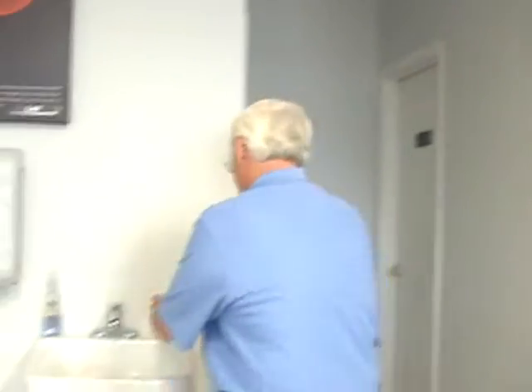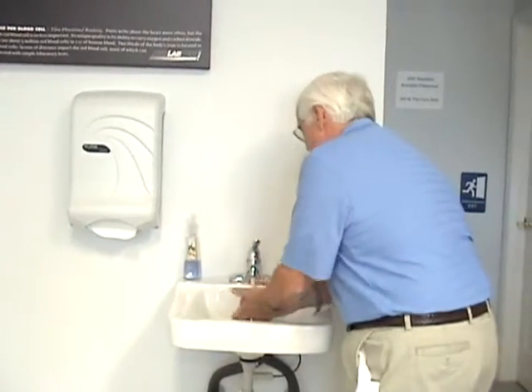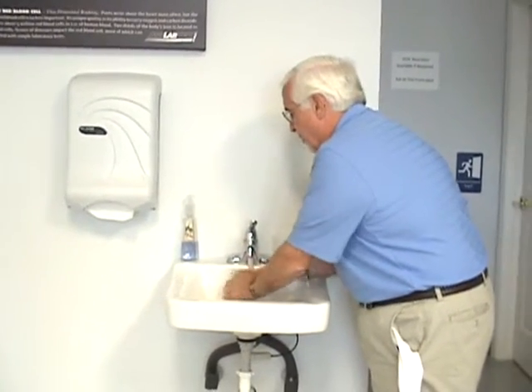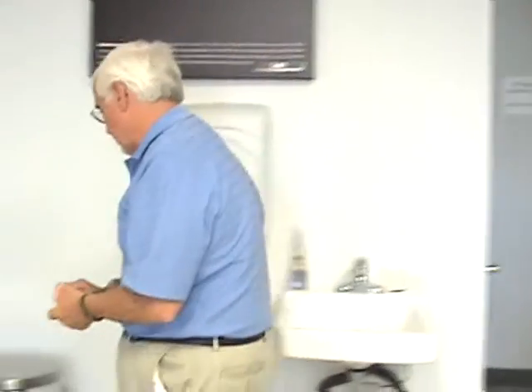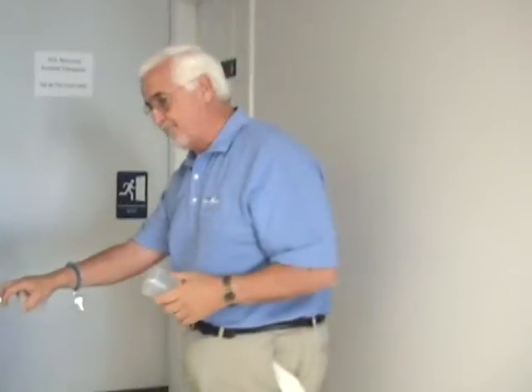We're going to walk over here and we're going to wash hands with soap and water. The idea behind this, guys, is we realize that sometimes there are adulterants that can be put on your hands that will allow you to adulterate the specimen, and we're doing our best for the employer to make sure that you don't get to use those. Now, from here, we're going to go into our restroom.